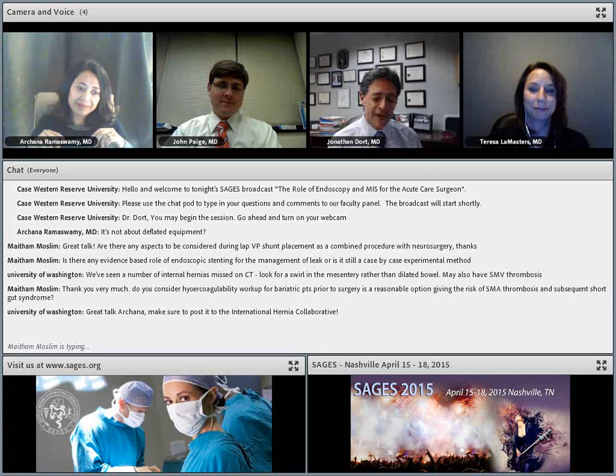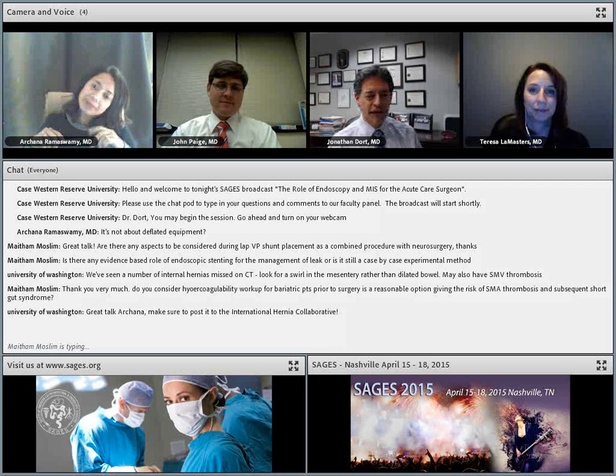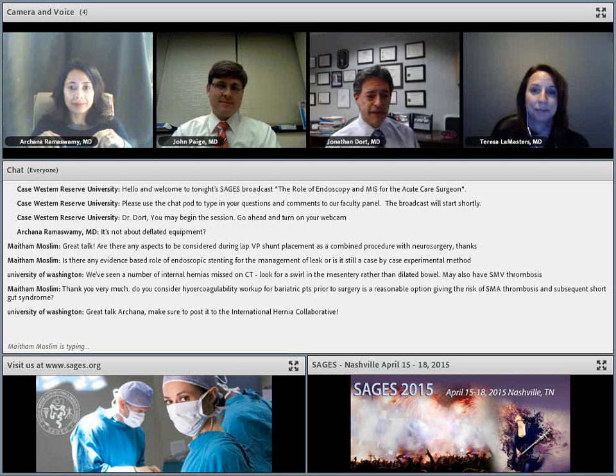But I've been successful where the previous surgical area has been small and the adhesion is easy to see and easy to lyse. I've gotten into other situations where it has been something other than an adhesion, and it at least has led me to be able to minimize the amount of laparotomy incision rather than doing a complete stem to stern. So I don't know if everyone else has had that experience.